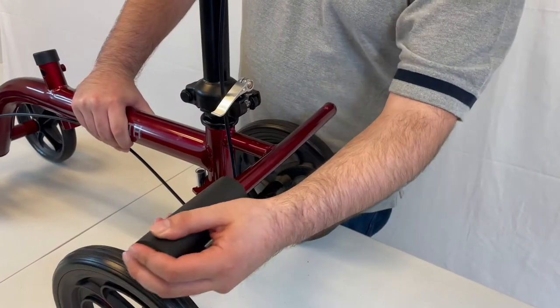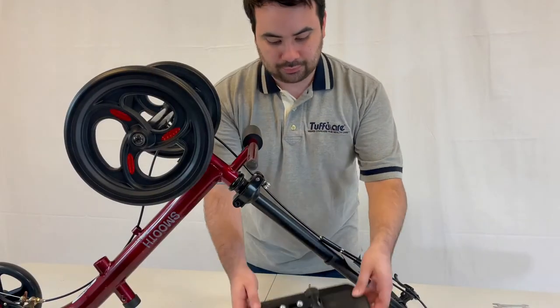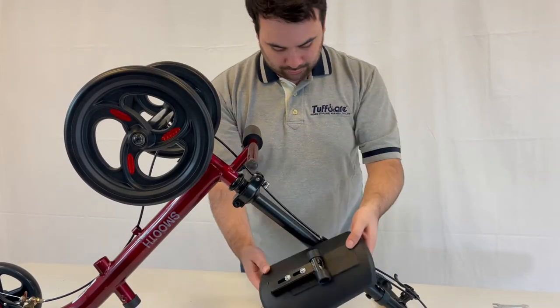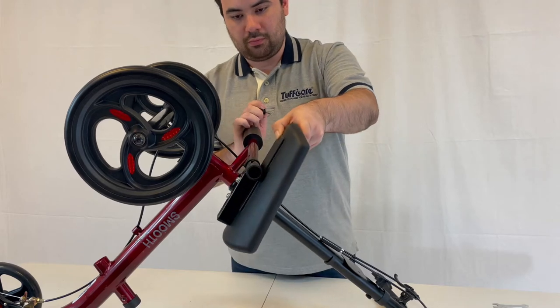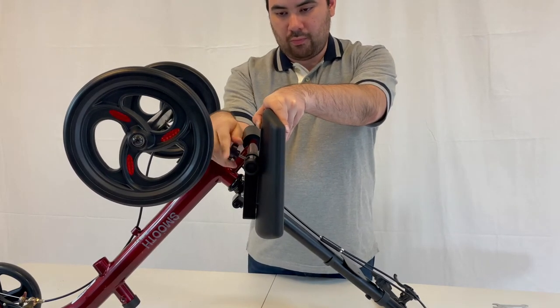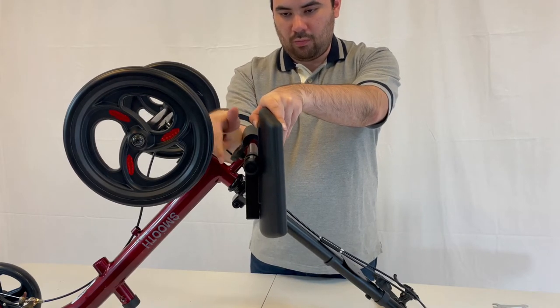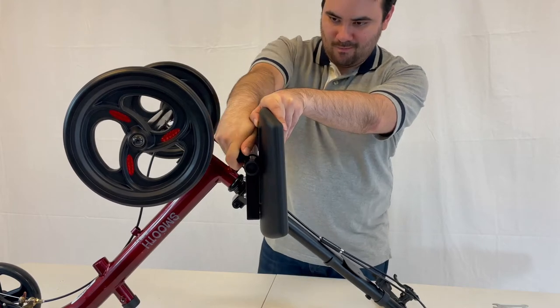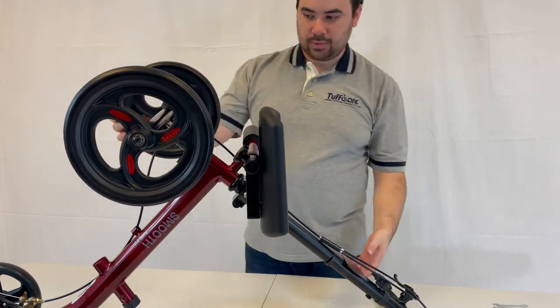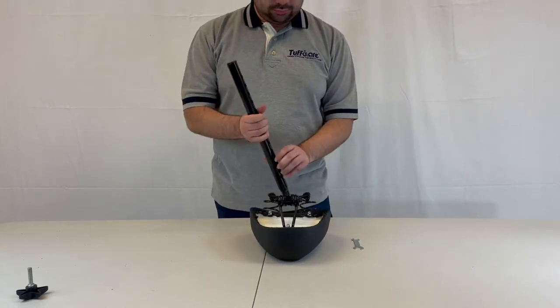Slide in the footrest pad to the opposite side of the injured leg. Slide the calf pad onto the side of the injured leg. Align the holes on the post and tighten the small knob. Slide the footrest pad to the side of the leg.